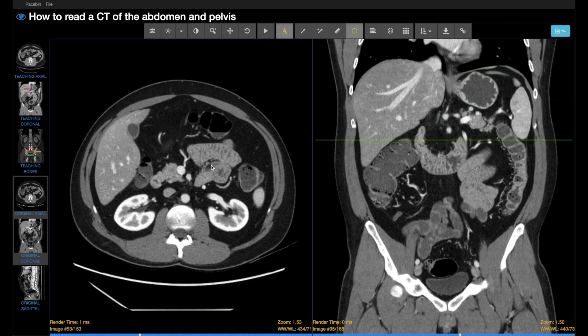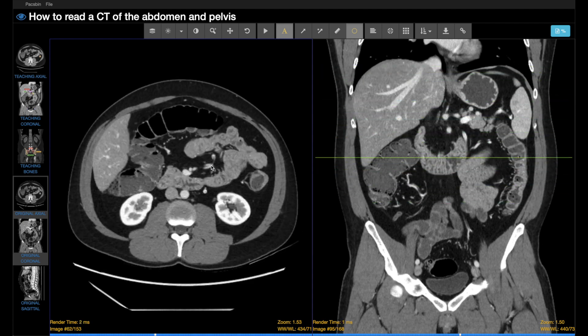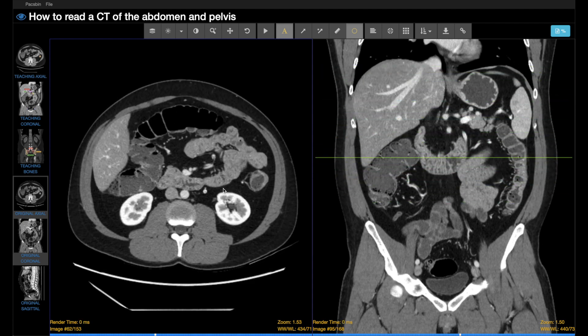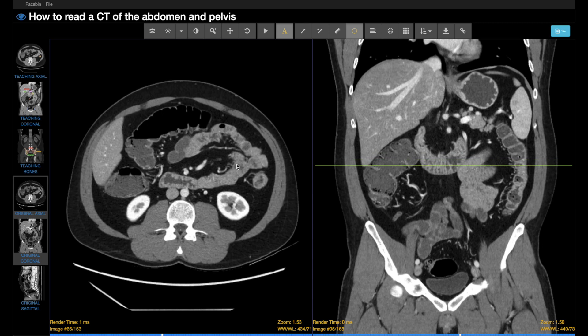As we scroll through the axial image, we can look at the craniocaudal slice to help triangulate abnormalities. Often you can double-click an abnormality and it will automatically triangulate on some PACS viewers, but that function doesn't work on this one.